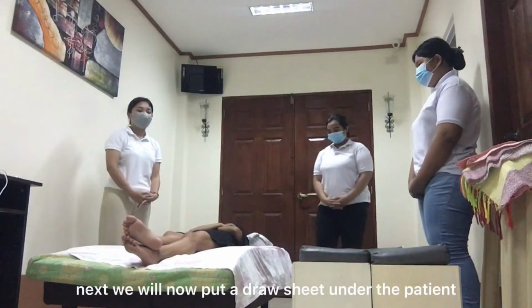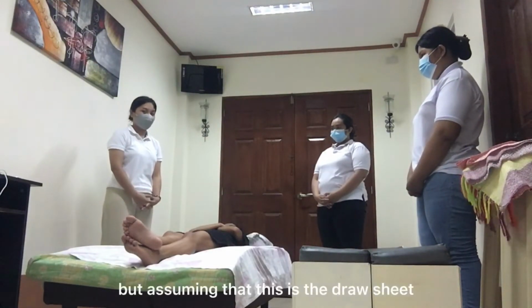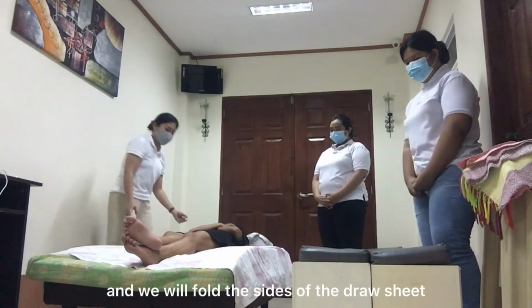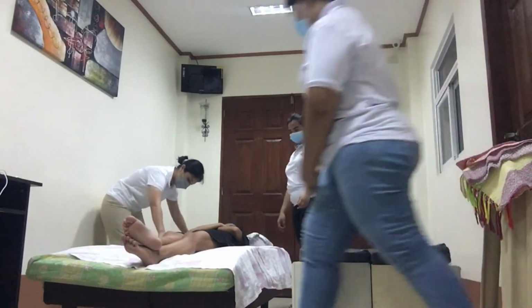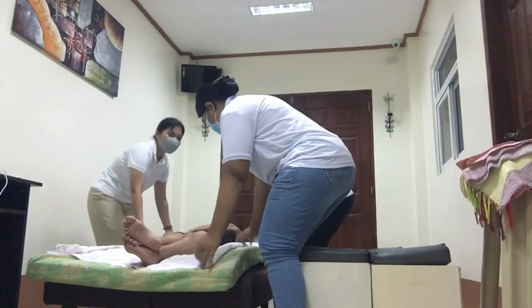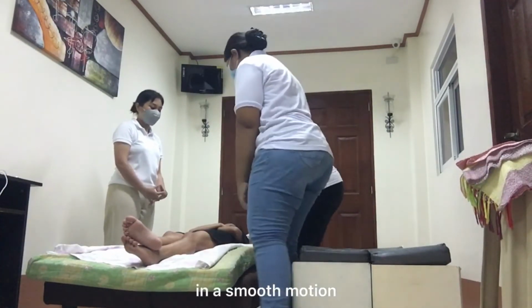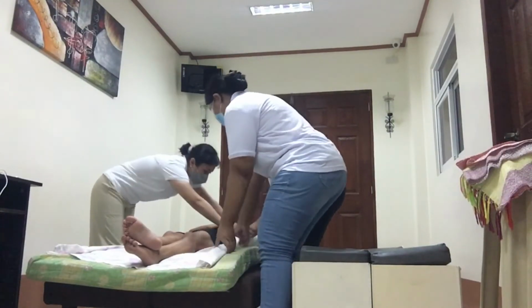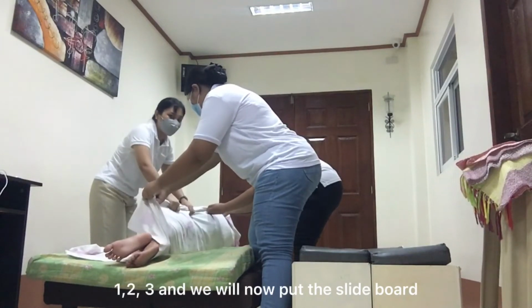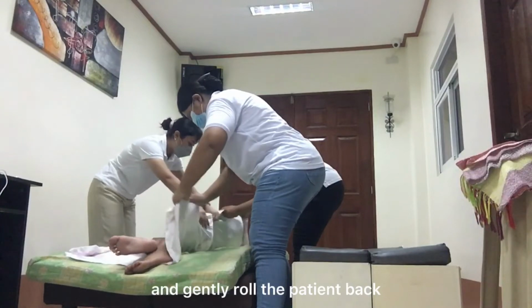Next, we will now put a draw sheet under the patient if one is not already there, but assuming that this is the draw sheet, we will fold the sides of the draw sheet. Next, log roll the patient on the count of 3 in a smooth motion. 1, 2, 3. And we will now put the slide board and gently roll the patient back.